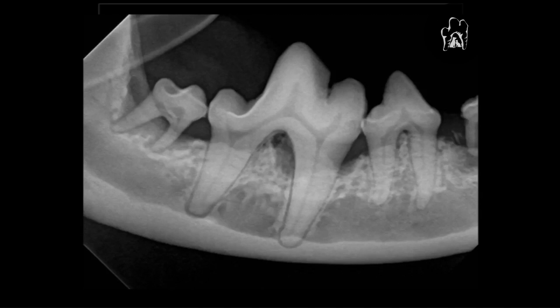On the other hand, we've got a decision to make on that first molar. You can see that we've got bone loss in the furcation, and we've got bone loss extending to the bone between the fourth premolar and that first molar.